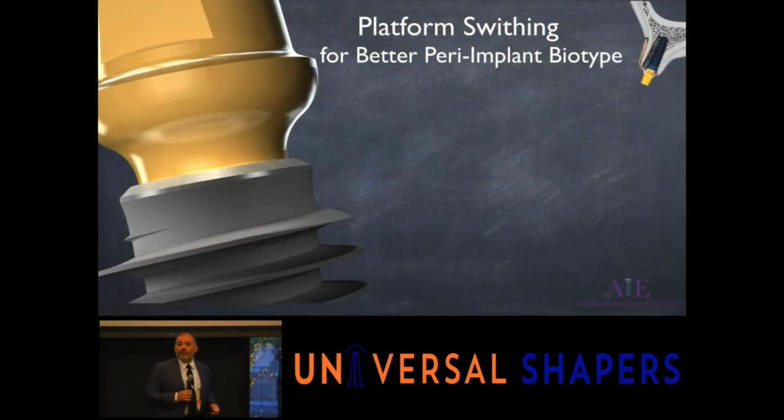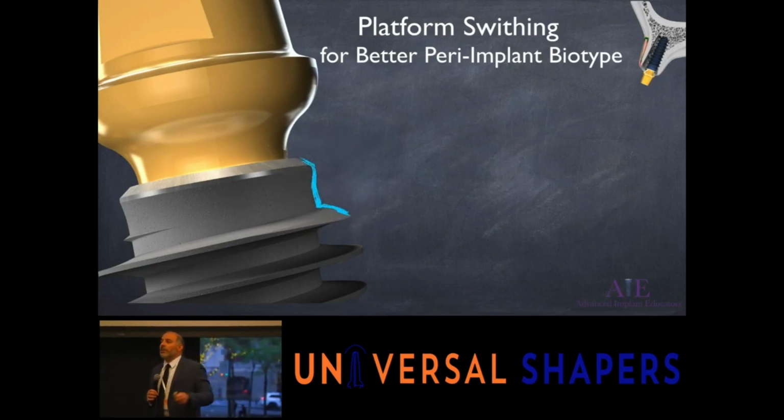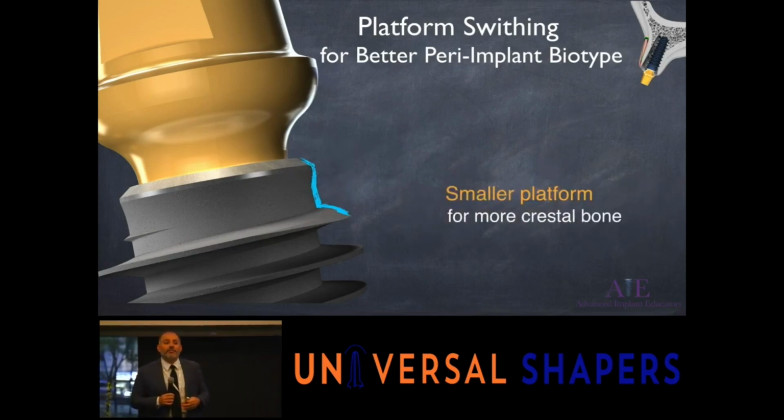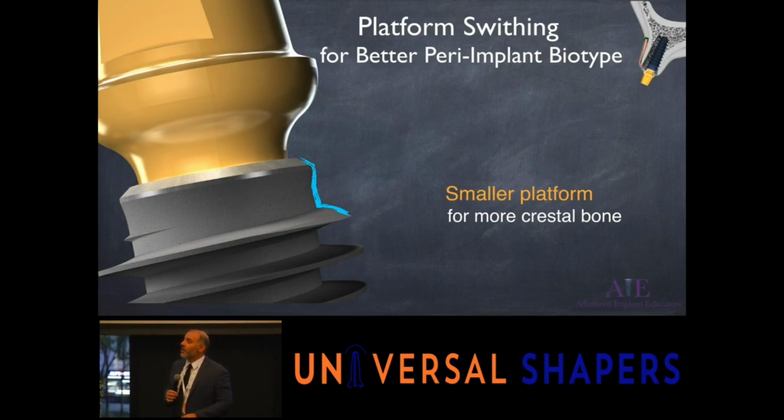Platform switching came out, and it's not that new. You would think, oh, this has been around for decades already. It's not that new. The idea behind it being, well, first, before I get to the platform switching of the abutment, let's talk about the platform switching of an implant. These types of cutback designs have a bone platform switch. So the thread starts lower down, and we have our first shift, the bone shift, the osseous platform shift.